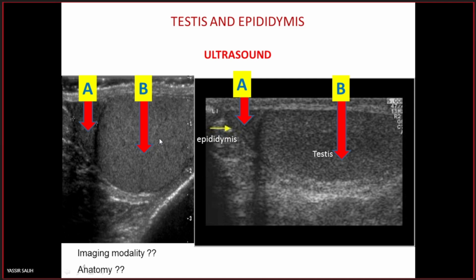The imaging modality in this one? Ultrasound. Yes. This A points to which structure? And this structure. Epididymis. What is this? Testis. Also, this is the ultrasound of the testis and epididymis.